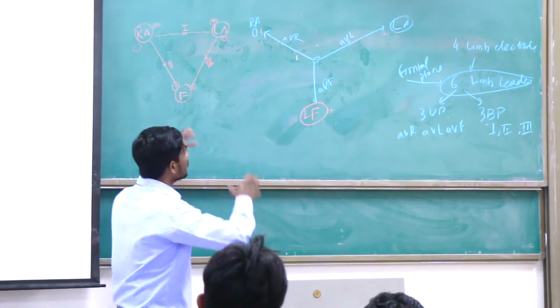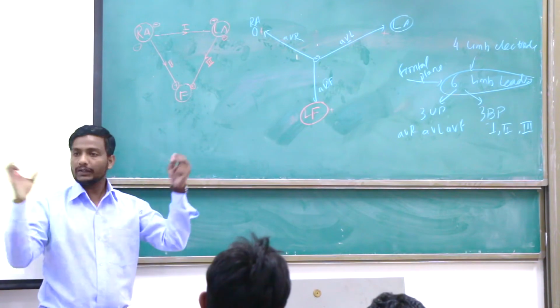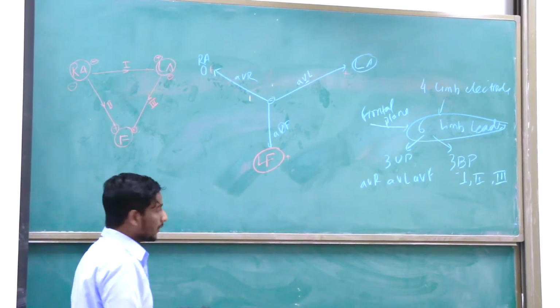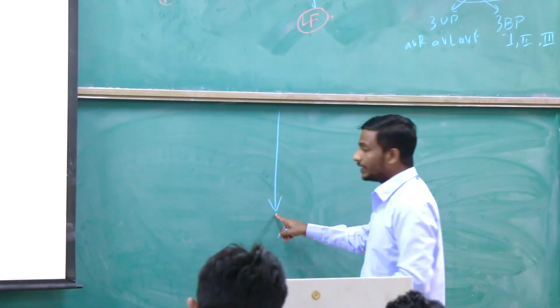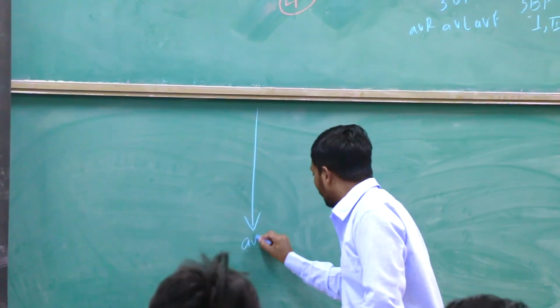And now we are going to do a very important job. We are going to put these three unipolar leads and these three bipolar leads together. We are going to form one hexaxial system. So when I bring these things together, how will it look? First of all, I am going to bring down one lead. Can you guess which lead I am talking about right now? Going vertically down? AVF. So this is going to be AVF.